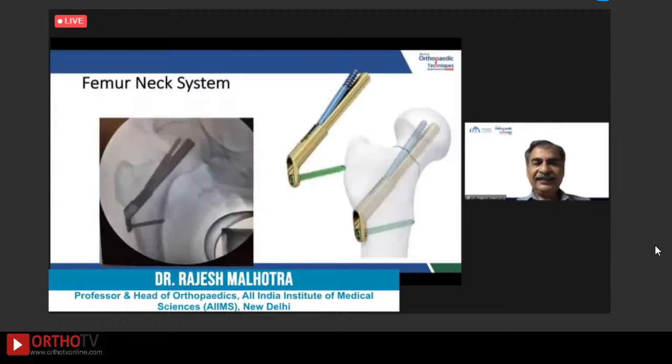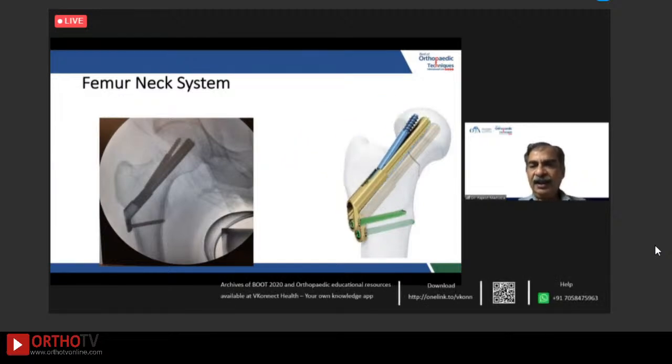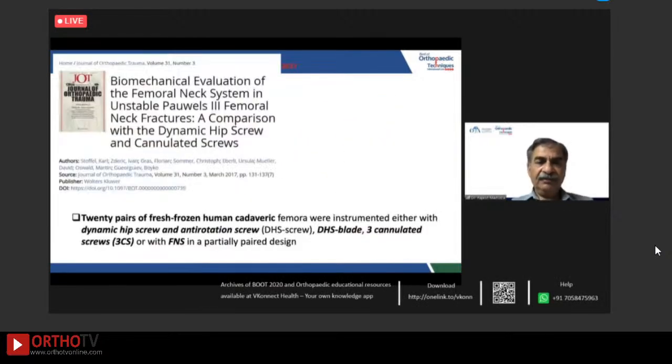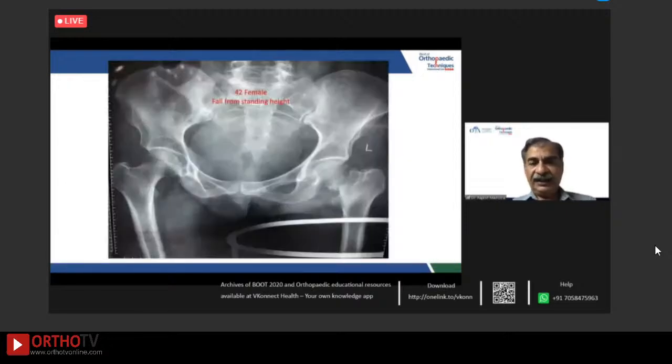This is an example of one of our own patients treated with the cephalomedullary nail for a fracture neck of femur. Now, the latest kid on the block is the femoral neck system, and that is actually a new system. The biomechanical evaluation has been done and published, and it shows that whether you are using a sliding hip screw with a blade or with the screw, or you are using the cannulated screws, this provides a valid alternative, and it has got advantages of being minimally invasive and gives good stability.